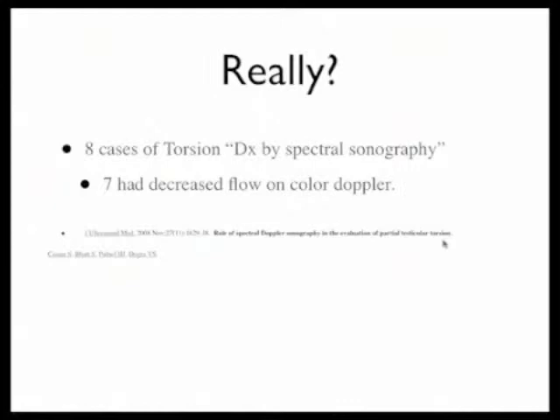So to be honest, I'm not really sure exactly how important this spectral Doppler thing is. I don't know how much it adds to our evaluation. I just couldn't find those studies. It's recommended by those people that we talked about earlier, Blavis and Straczynski, who write the chapters on this. They all talk about it and they all recommend it. And so I'm sure it definitely adds something to the evaluation, but I'm just not sure how much. Unfortunately, I couldn't find that information to give to you.